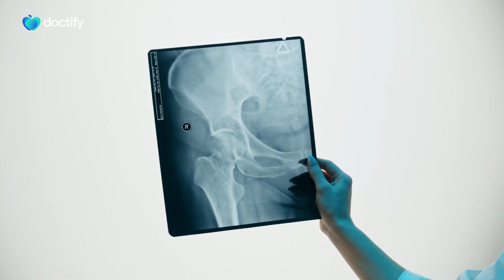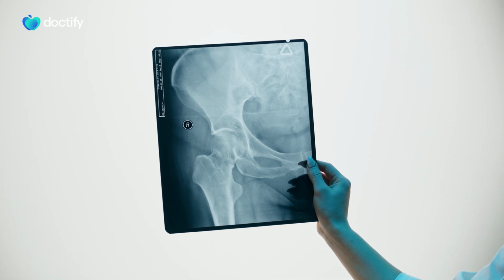Then, what the operation involves is key. Patients usually come in to the hospital. They have an anesthetic assessment, and the anesthetist has a discussion. They usually have a general anesthetic. They're put on something called a traction table. We look at the hip under x-ray guidance. We make some cuts around the hip and put the cameras inside. The extra bits of bone which cause impingement, we usually remove, so we shave off the bits of bone.